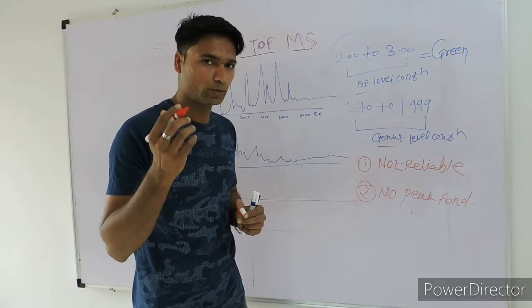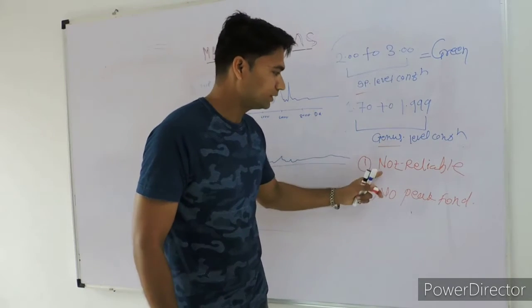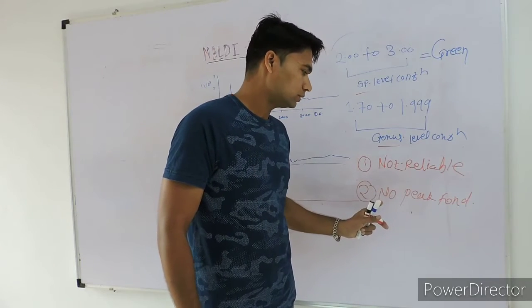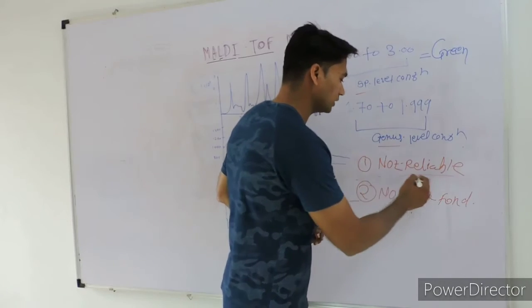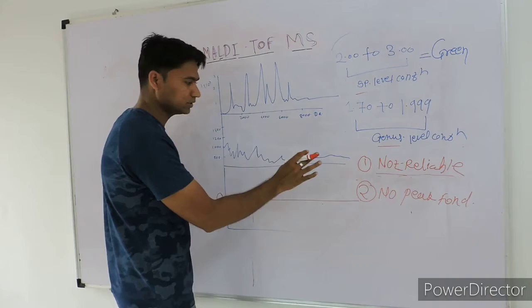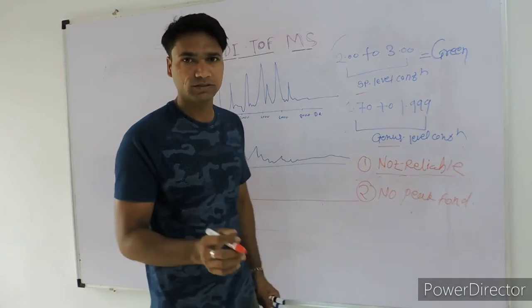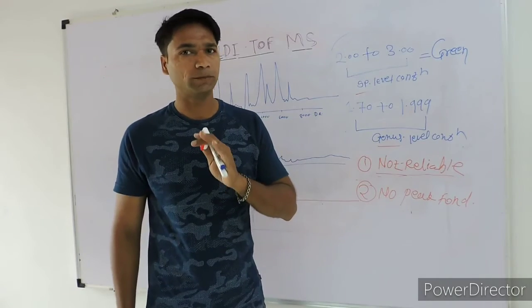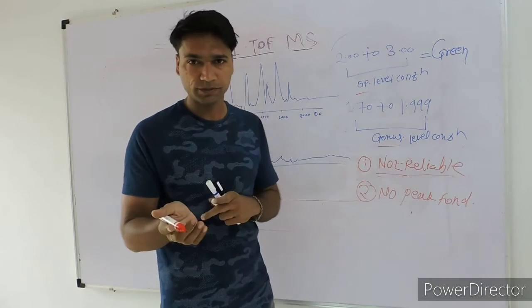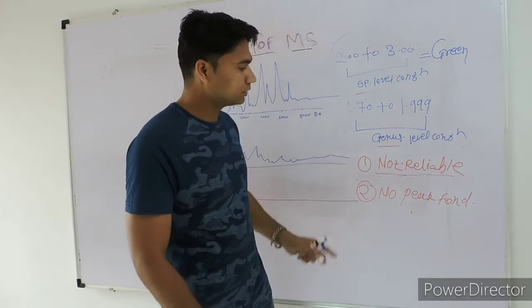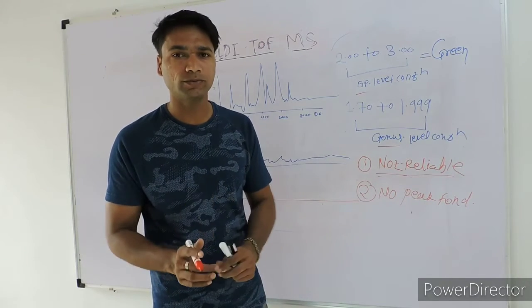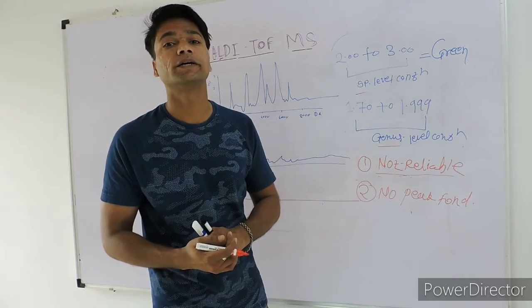Whenever you have the result and you see the red color, it is either non-reliable identification or no peak found. There are two probabilities. One is that the spectra doesn't match properly — that's the reason MALDI-TOF MS is not able to identify up to the genus or species level. But what happens whenever your spectra is good? Sometimes it happens that the spectra is good, still you don't get a reliable identification. Why does this happen? It is a limitation — it is nothing but a database limitation.